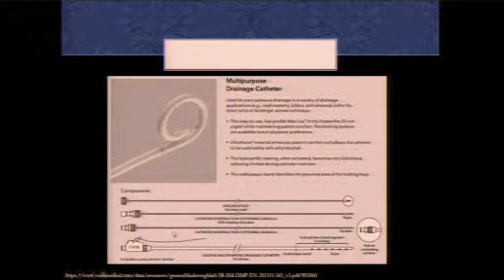And this is the catheter that they use at St. B, which is the Cook's catheter. And this shows you that the catheters come with a stiff cannula, which can be either metal or a more flexible plastic material. And the locking mechanism for this is basically you pull the string over a little tab to lock it in place. And this one is also hydrophilic and has that radiopaque band.